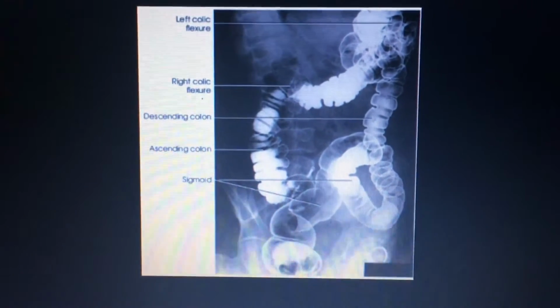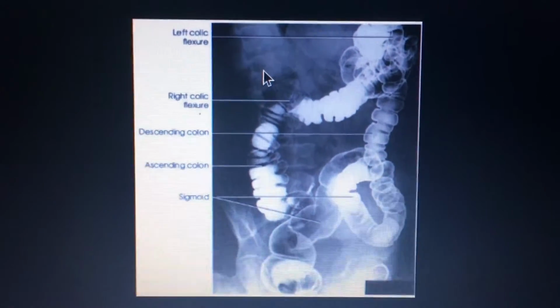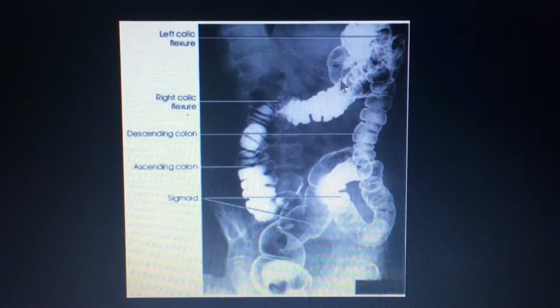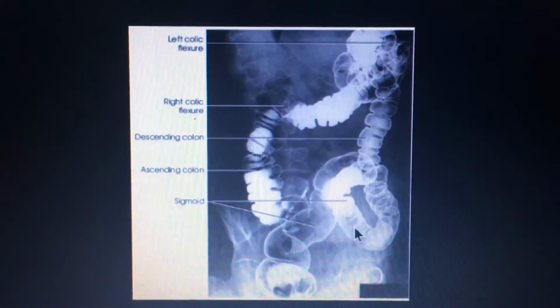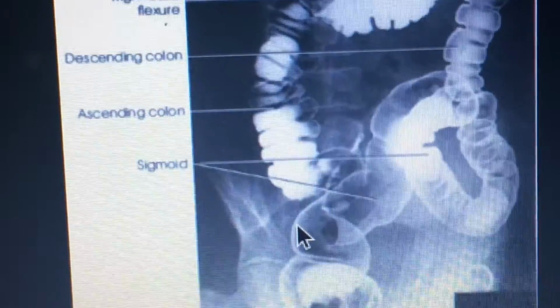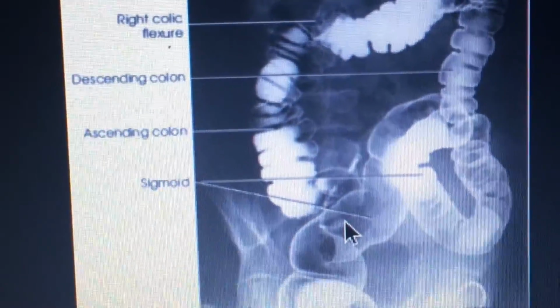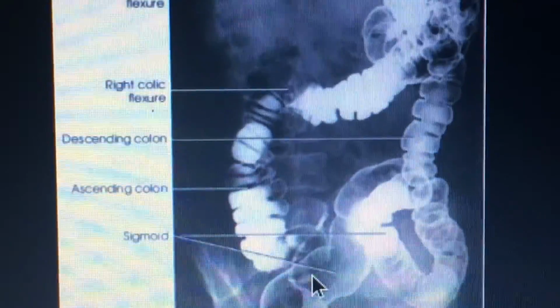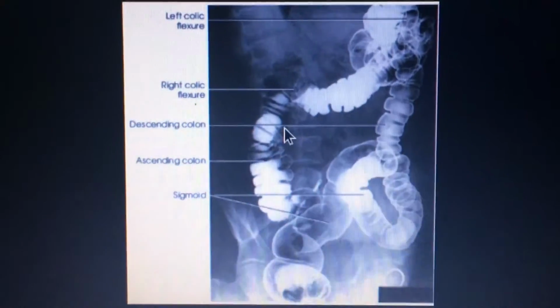So this next one, you can see the right colic flexure has opened up. So this would be the RAO, the right anterior oblique. The left colic flexure is superimposed over itself. That's why it kind of looks like a little mess. You see the double contrast. You don't see no haustral rings down here, so that could be the sigmoid. It looks pretty dilated right there. That's probably because of the enema tip. But you can see all the haustral rings. That's a good sign.